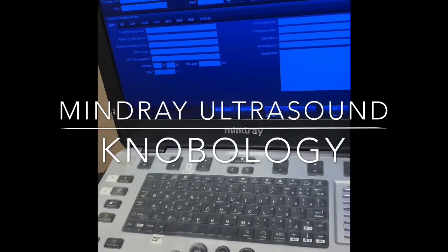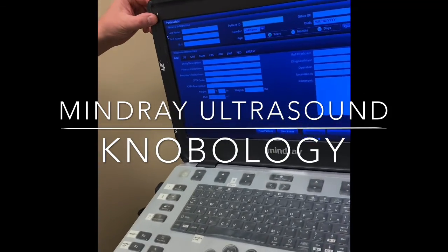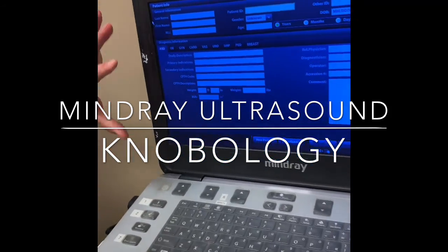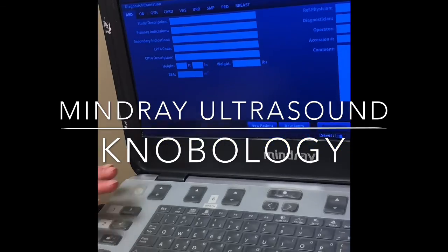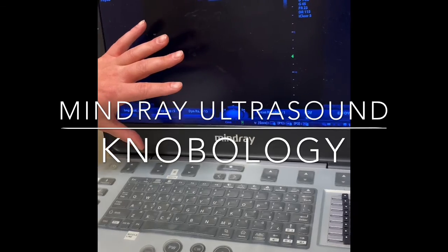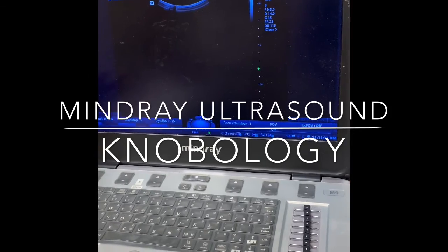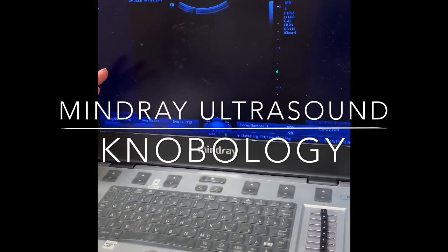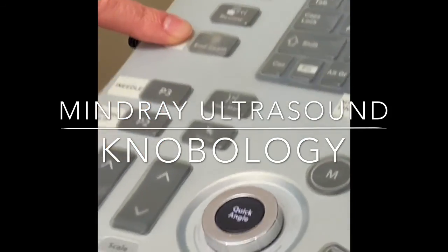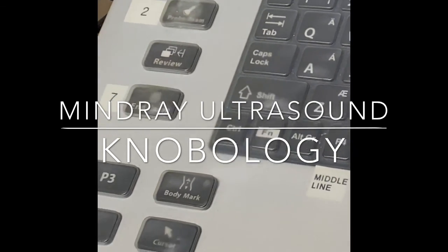When you first open the lid of the machine or turn on the machine, it will be on the patient information page. The on button to get to that page is right here. Now, if for any reason, when you approach the machine, you see the scanning screen with images that will pop up here from another provider's study, that likely means that they forgot to end their exam. What you do at that point is press this end button right here. If that doesn't bring you back to the patient screen, you click number 1 where it says patient, and now you will be on the screen.